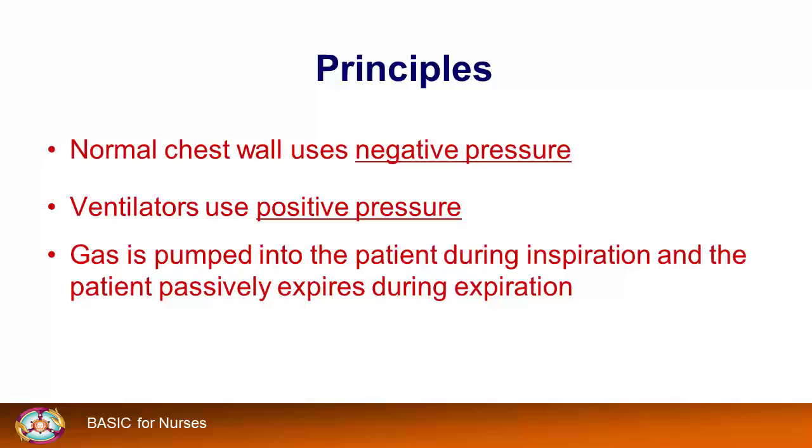But in fact, the first mechanical ventilators were negative pressure ventilators, called iron lungs. These ventilators worked by pulling the chest outwards, forcing the patient's lungs to expand, drawing air into the lungs, and then allowing the chest to collapse and air to be exhaled. This is similar to normal physiological ventilation, but the patient needed to be heavily sedated and may have a lot of complications, so it's rarely used now. Although negative pressure ventilators still exist, modern-day ventilators are almost always positive pressure ventilators.